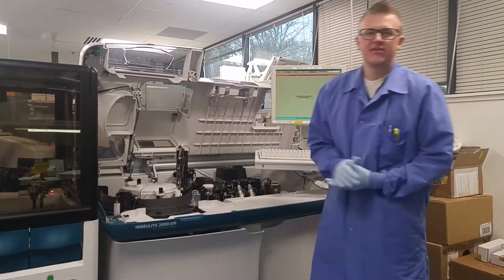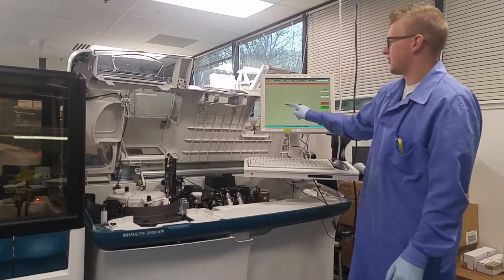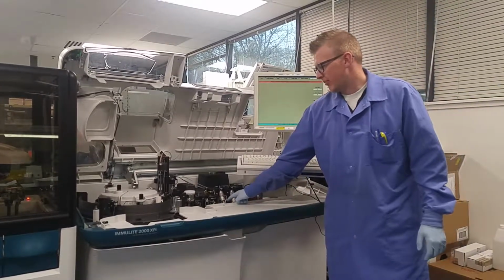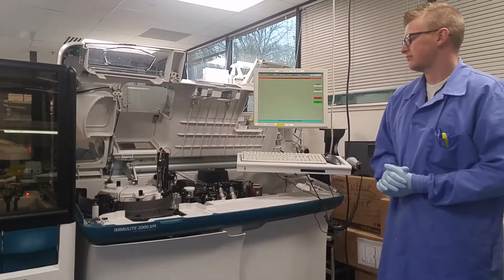From what I'm seeing here, I have a steady full stream. It's going into the blind hole directly, so it passed. So you're going to press confirm that the probe angle passed, press to end program. This is the water pump. It has to purge everything that it had sucked down into it.